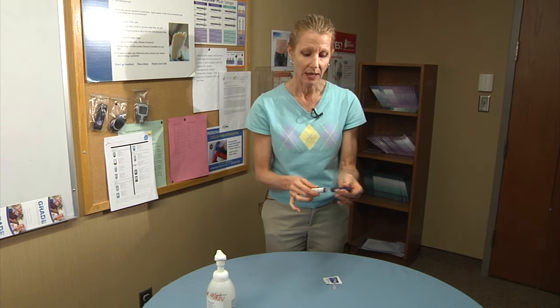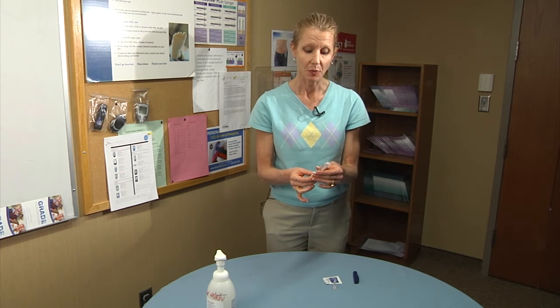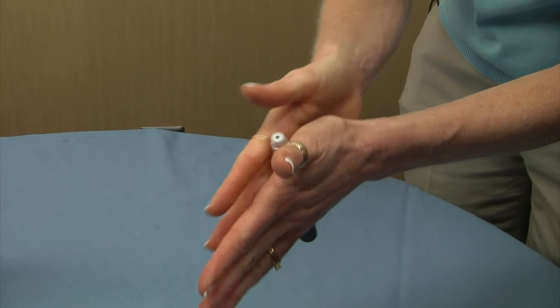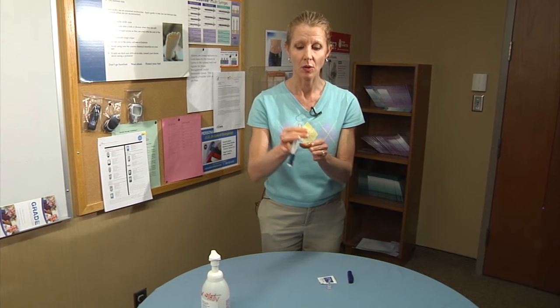Start by removing the cap to the pen. At this point, if you have cloudy insulin — which would include NPH insulin or a mixture thereof — you want to mix it. You mix it with your palms, rolling it together, or you can go gently back and forth. You don't want to rigorously shake it.